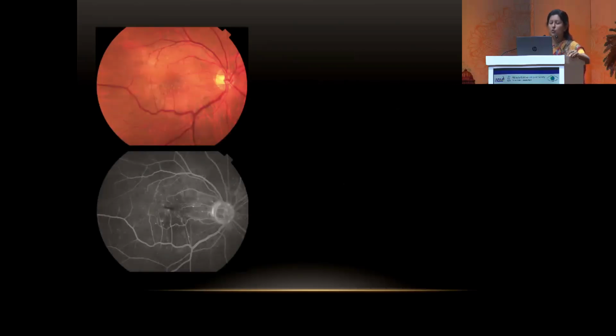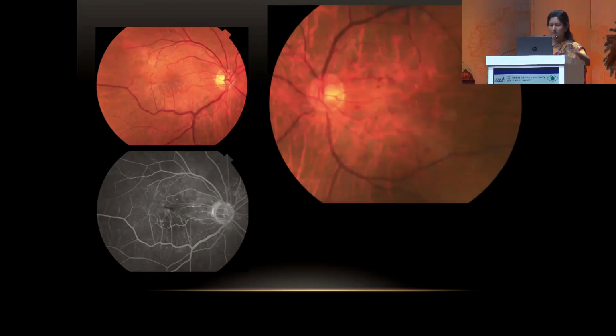So venous stasis retinopathy may in fact be an earlier stage of the full-blown ocular ischemic syndrome. So this was a 55-year-old male. The right eye was asymptomatic, though you can see some venous dilatation here in the inferior part, and this is the left eye. So if you look at the veins, you can see the darkened color and the thickening of the veins. Very subtle hemorrhages.